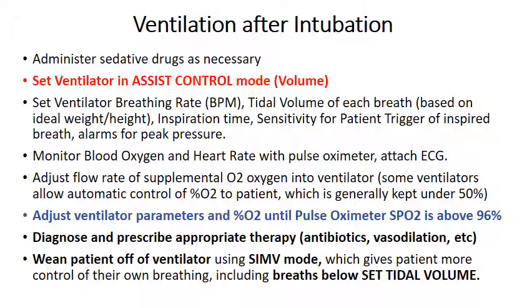and also something that oxygen analyzers are needed to calibrate, because many of these devices have the ability to set oxygen percent when mixing supplemental oxygen into the ventilated breath. And so the analyzers are necessary not only for oxygen concentrators, which can deliver nasal cannula oxygen, but also for testing whether ventilators are delivering the controlled amount of oxygen saturation to the patient.